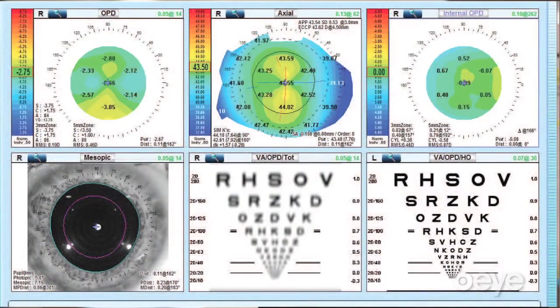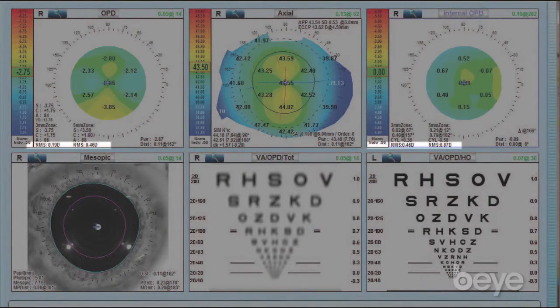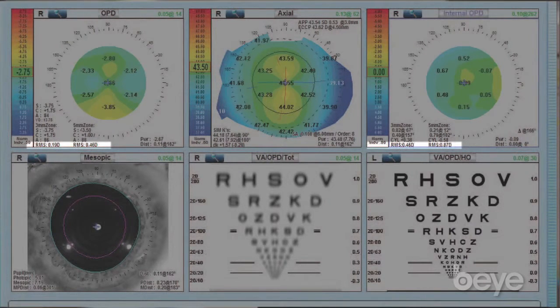The first thing I look at is the root mean square, the RMS value. The RMS value tells me how clean the image is of the light going in and out of the eye. If the RMS value is high, that means the patient's post-operative outcome will most probably not be 20/20 due to underlying pathology — it could be macular issues, it could be corneal issues. It tells the surgeon and the patient that you have to set proper expectations that the vision may not be 20/20.